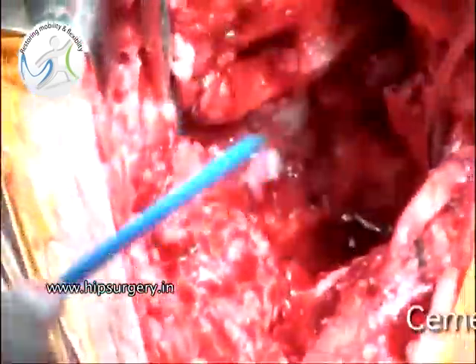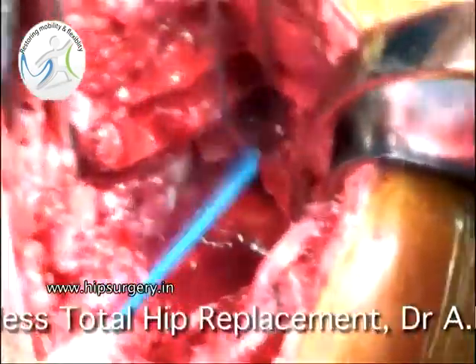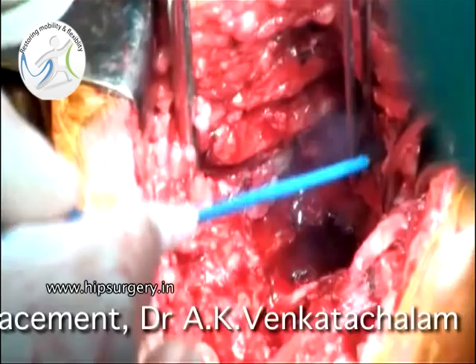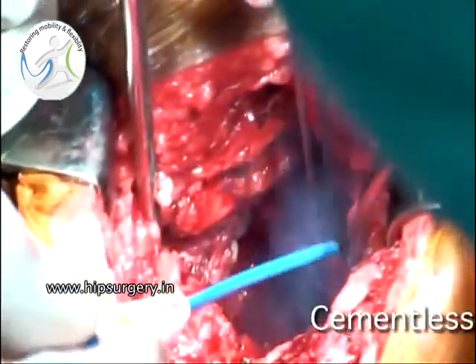The margins of the acetabulum are denuded of all soft tissue attachments and the rim is cleared of the labrum circumferentially using a bovie.